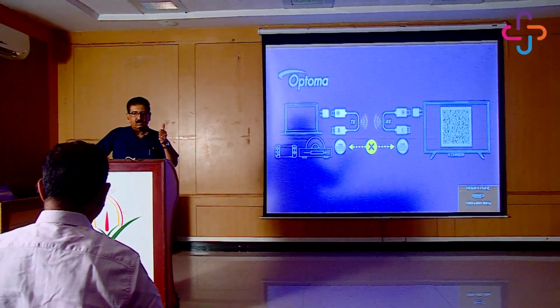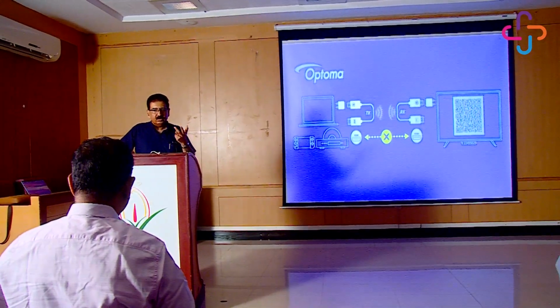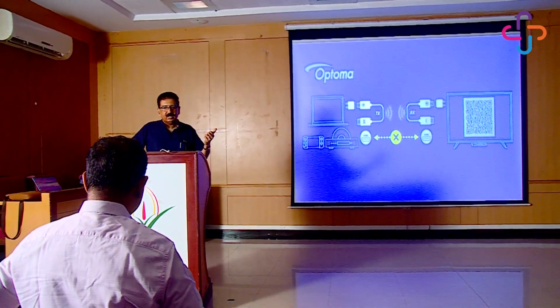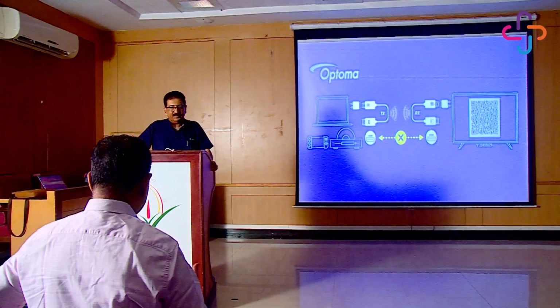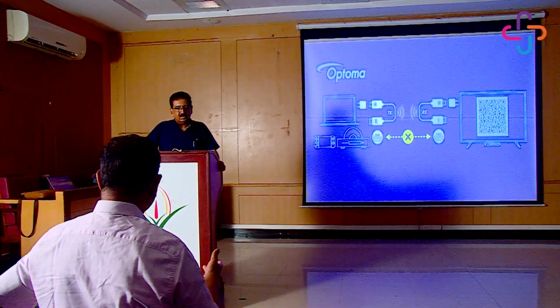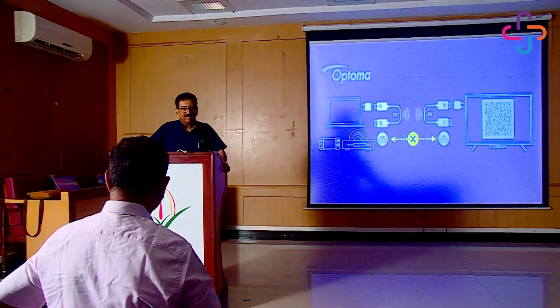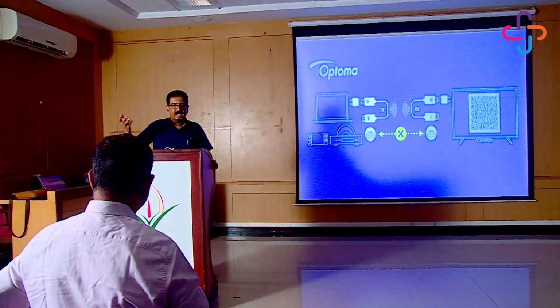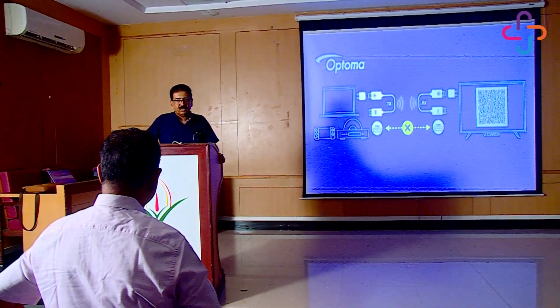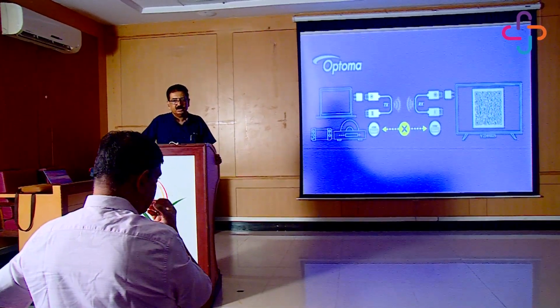Clinically, we cannot make out. So one is CT angio. Fluoroscopy during the angio shows the calcium. So these two tools are usually used. During the procedure, we use intravascular ultrasound and OCT. See, most of the elderly will have calcium, and when we do the angio, on fluoroscopy we can see the calcium. If we see significant calcium on the fluoroscopy, then before angioplasty, we have to go prepared to use one of these tools.